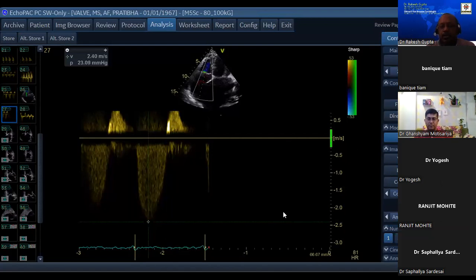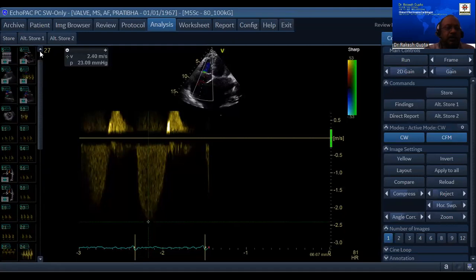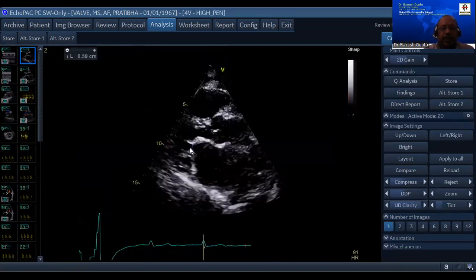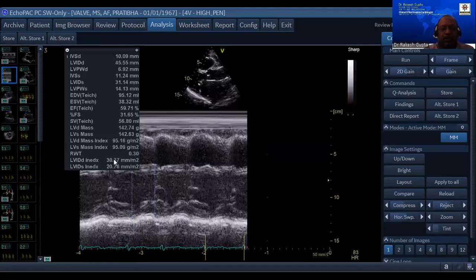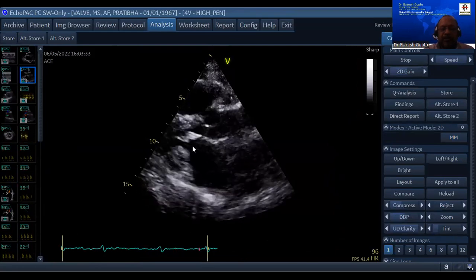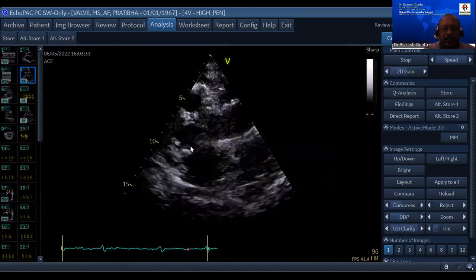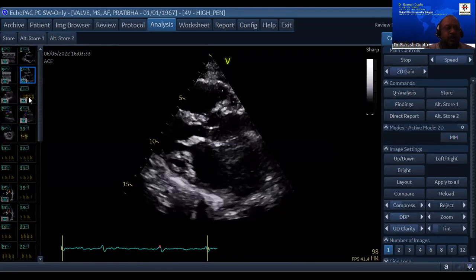All right. So let's summarize the features for mitral stenosis. I am going to show you all the slides one by one now. Dilated LA, cusp separation 0.6. LV size should be almost normal, 32 or 30. Then thickened calcified mitral valve leaflet with restriction of cusp motion, doming of AML because of thickening of secondary cords. The distance is almost reduced for opening.